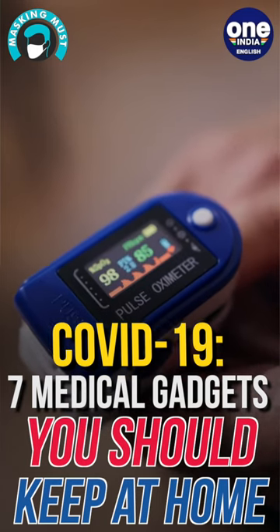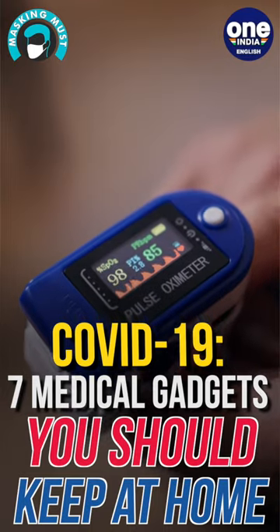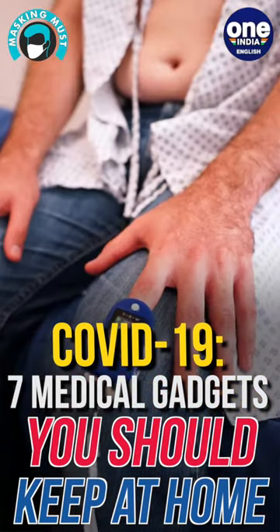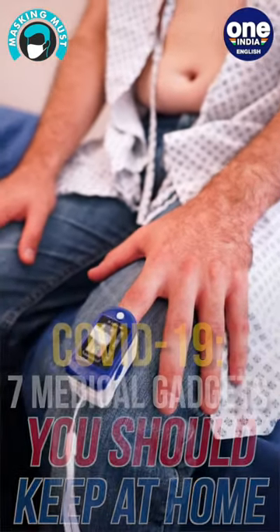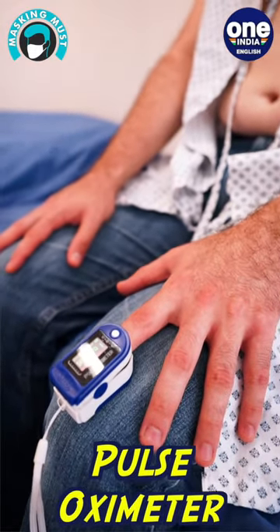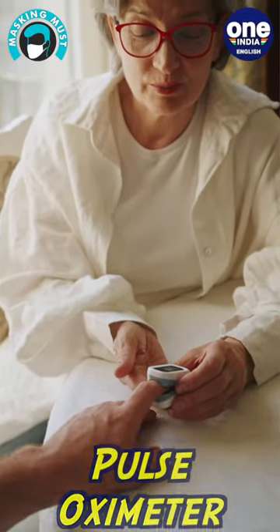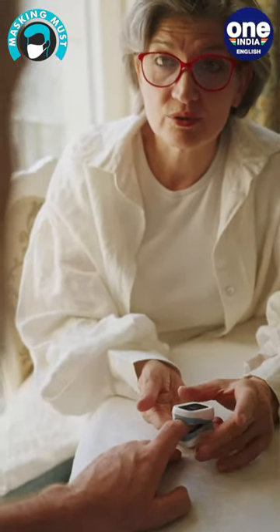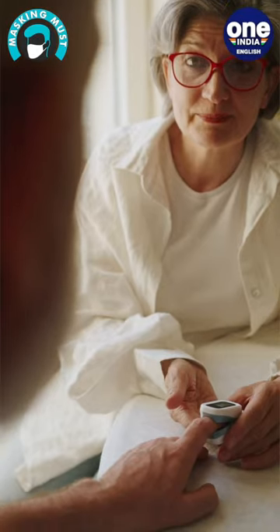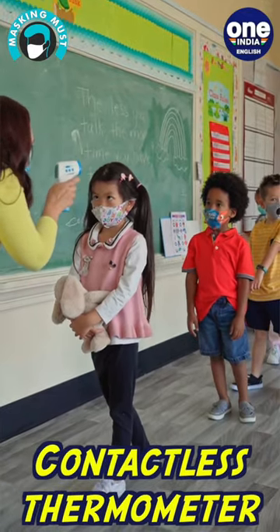A pulse oximeter is a painless and reliable way to measure a person's blood oxygen levels. It is a tiny device that usually slides over your fingertip. It reports blood oxygen levels via an oxygen saturation measurement called peripheral capillary oxygen saturation, or SpO2. A person with COVID-19 can have very low oxygen levels, and thus an oximeter can help to monitor your oxygen level as well as the pulse rate of the body.